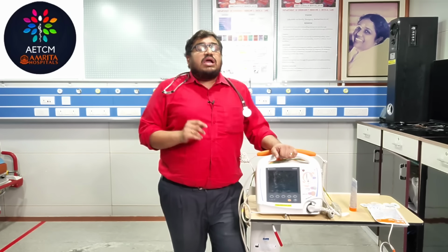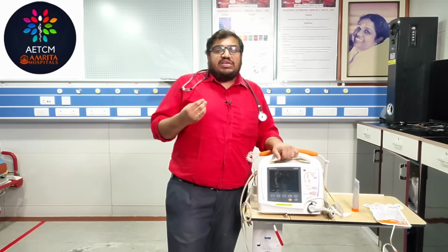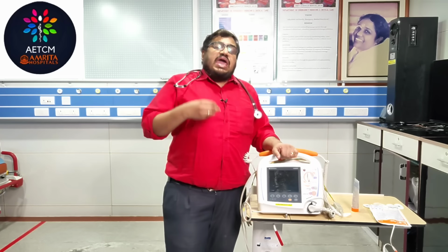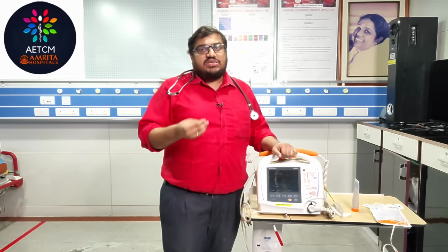Next coming is the cardioversion. Many people have a doubt: what exactly is meant by cardioversion? Cardioversion we use in case of unstable arrhythmias or arrhythmias refractory to medication. So again, cardioversion we use for unstable tachyarrhythmias.